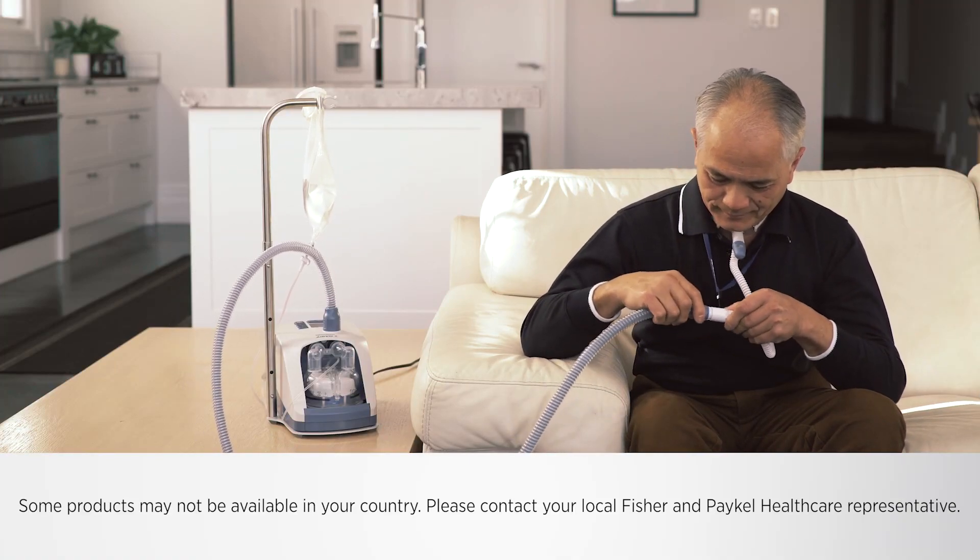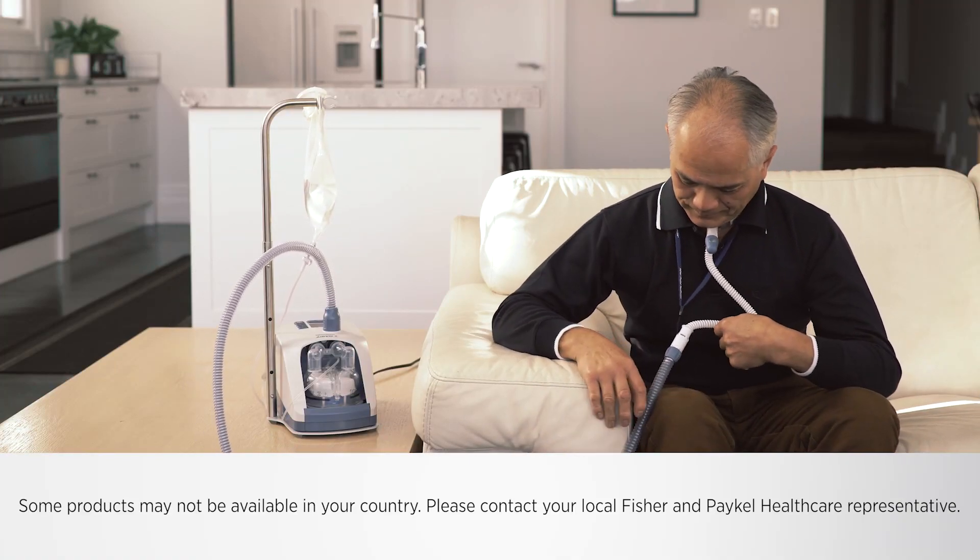The MyEVO2 can be used with a variety of patient interfaces. Read the separate user instructions for the patient interface that will be used, including all warnings.